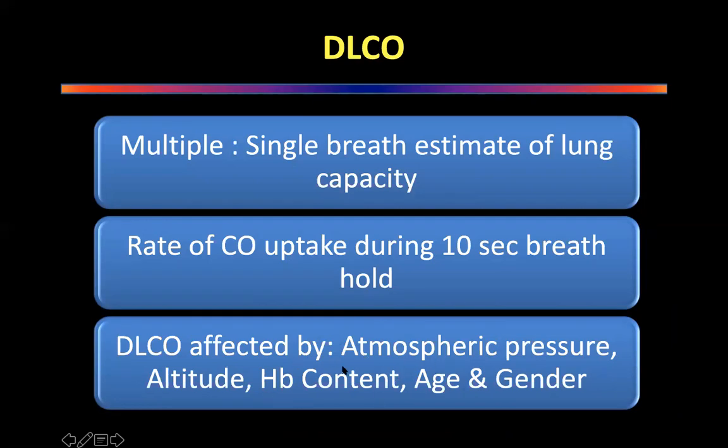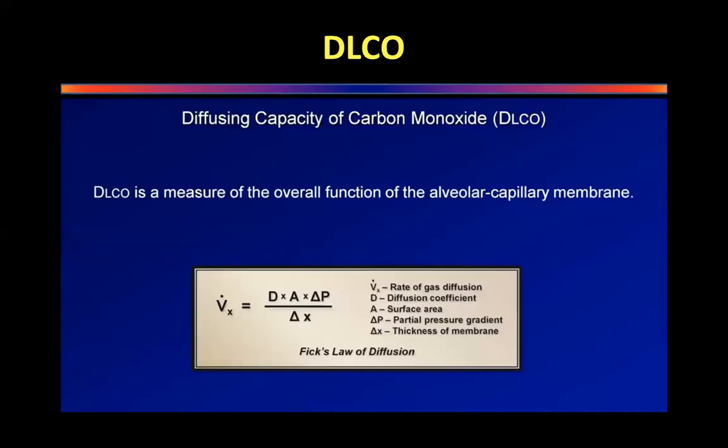The newer machines actually can calibrate even for anemia. So it's not a problem. They can actually, even if you've got low hemoglobin, they take that into consideration. And when the final results come out, there is a calibration of it to stabilize your readings.